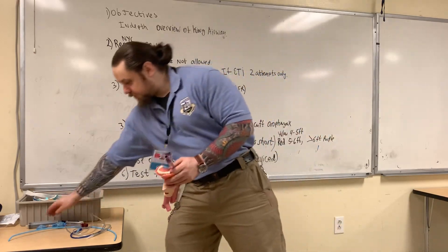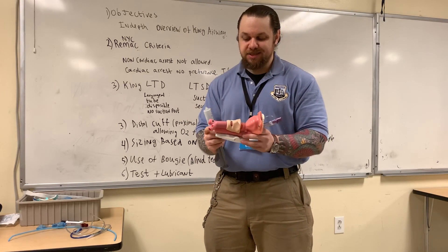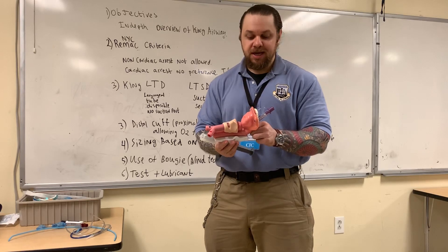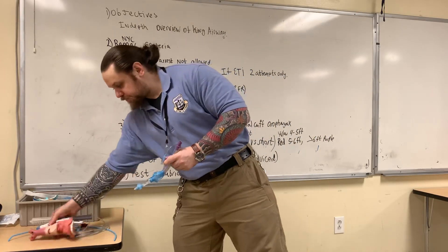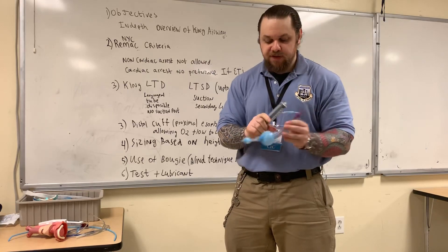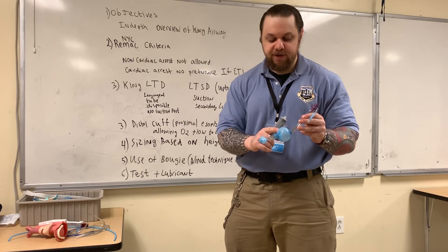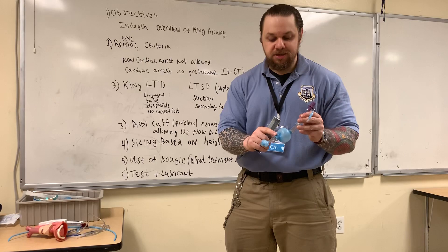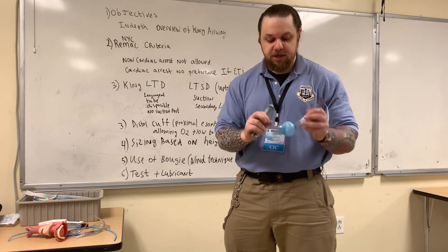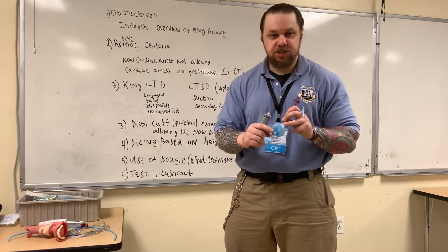When I inflate these cuffs with the syringe provided, the distal end sits at the proximal esophagus and the proximal end sits at the oral pharynx. When these cuffs are inflated, the distal cuff in the upper esophagus and the proximal cuff in the oral pharynx will isolate the laryngeal inlet, thus not allowing passage of air distally to the stomach and not allowing air to escape through the mouth. You can see there are openings in this tube where oxygen will flow to facilitate oxygenation and ventilation.